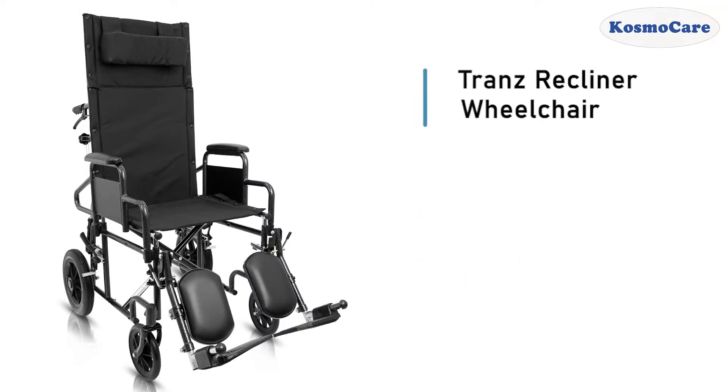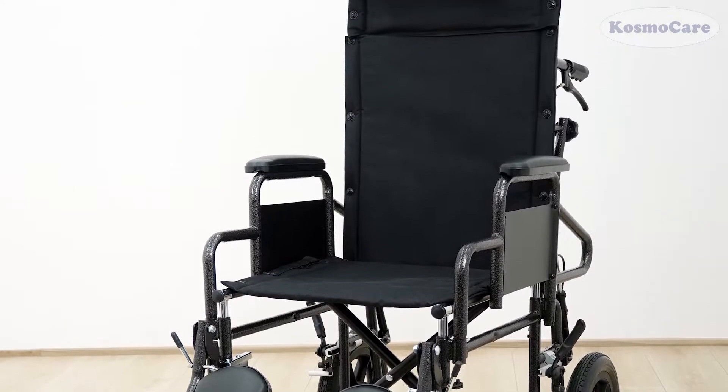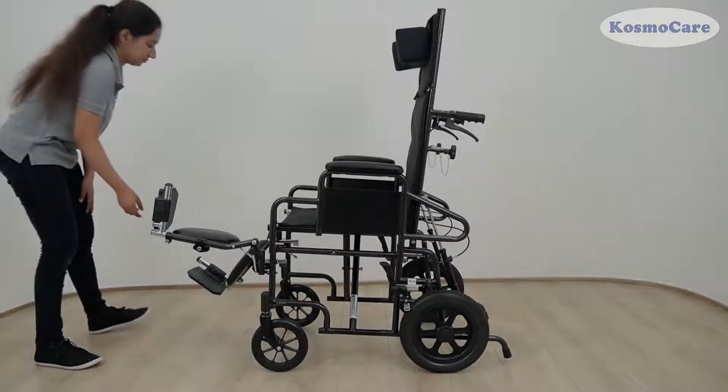CosmoCare Trans Recliner Wheelchair offers a versatile solution for those with limited mobility. The reclining wheelchair helps distribute body weight for users using the chair for longer duration.